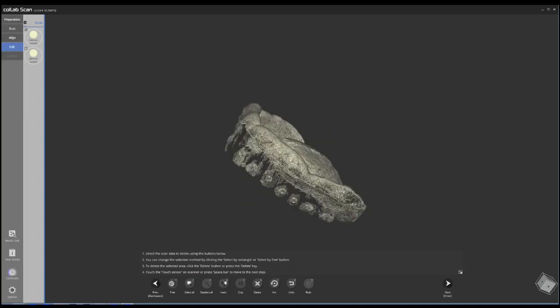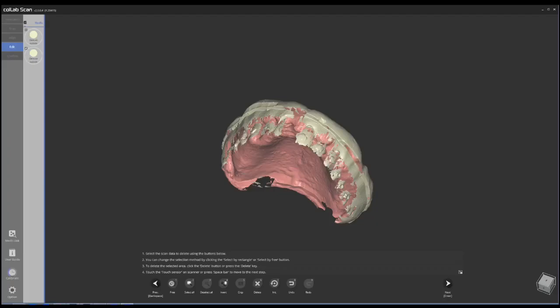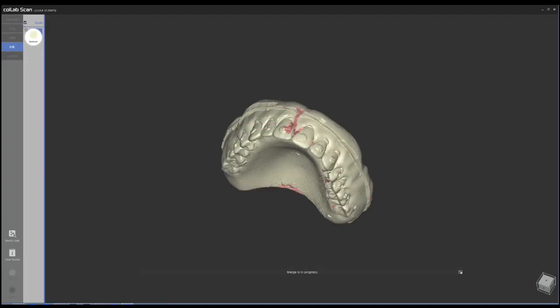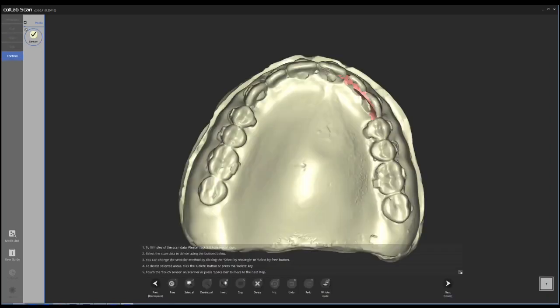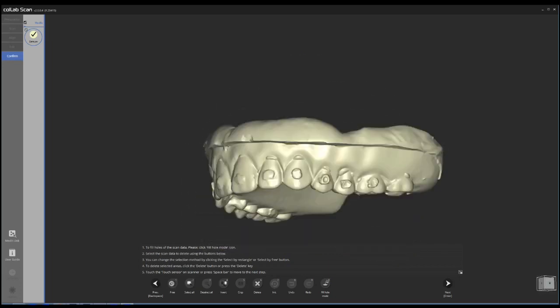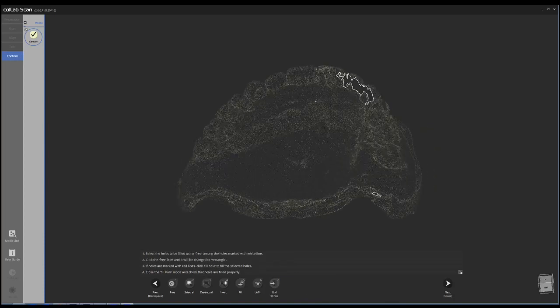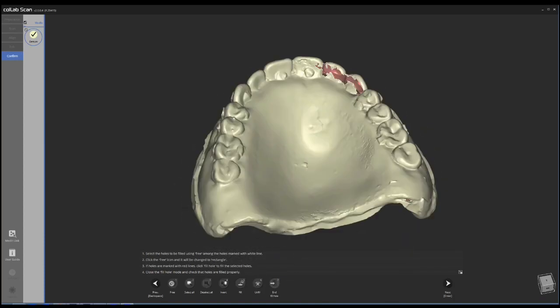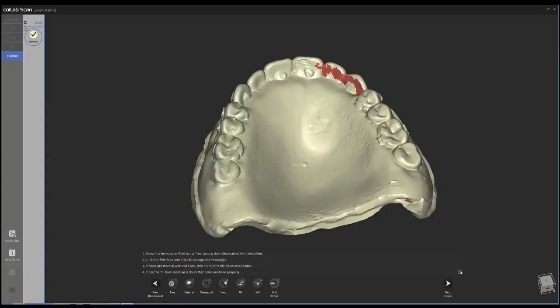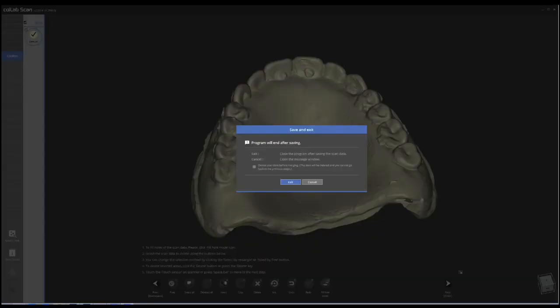So you're going to end up with two different scans. You accept the data and then merge the two files into one single STL file. In this case, we end up with a couple of little holes as you will see right there. There's a function in the software that will allow you to select the hole and then just fill it with one click. Once it's complete, you accept the data and now you can export the STL file for your planning.